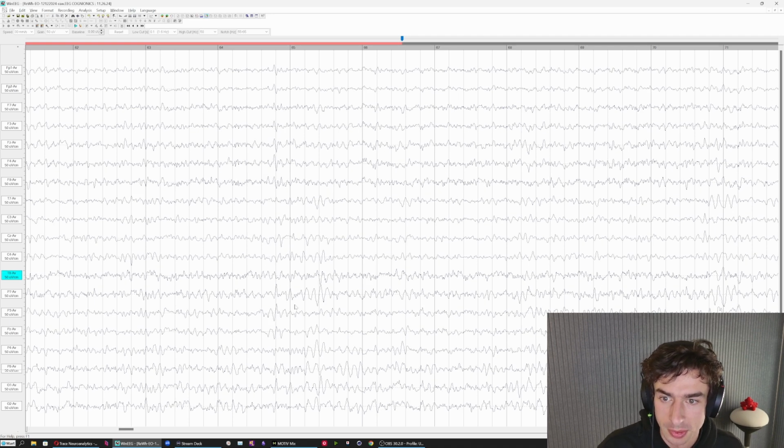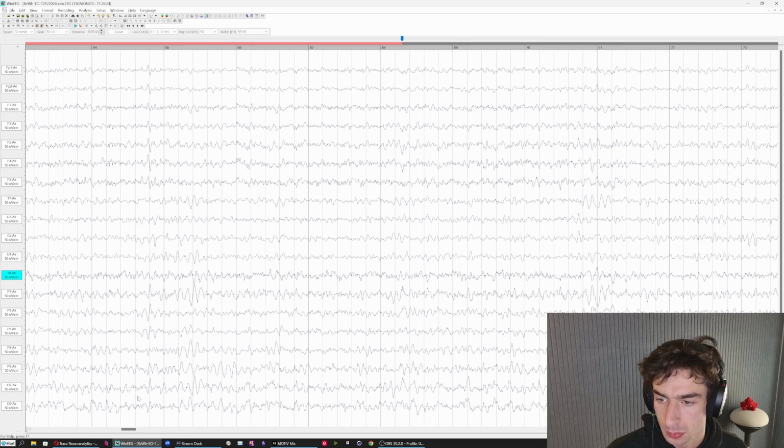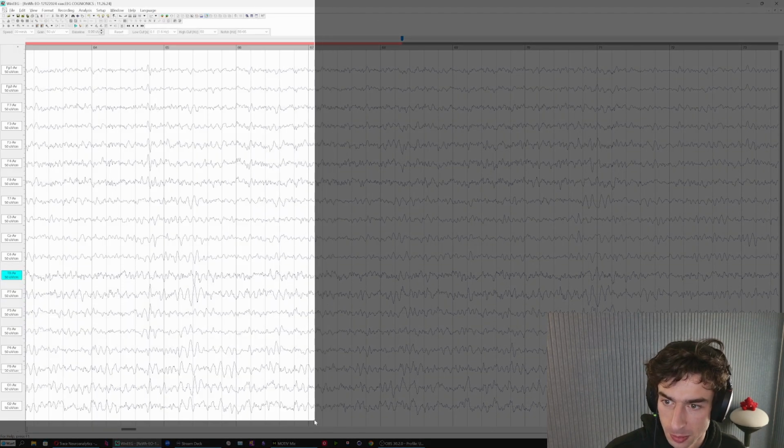This is interesting here. Sort of a spiky feature, not really sure what that is. Could be some sort of an event-related potential. Has phase inversion from front to back, and is followed by more of that sort of left posterior temporal slowing.